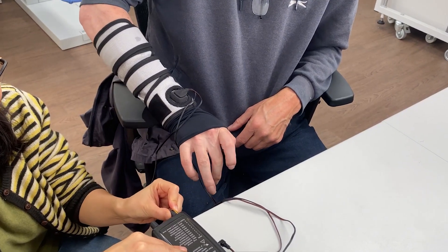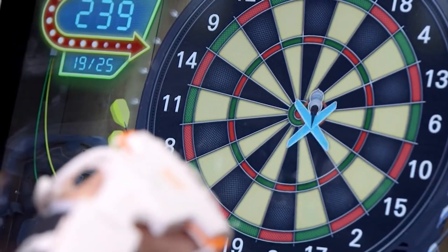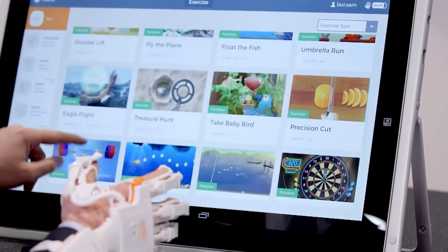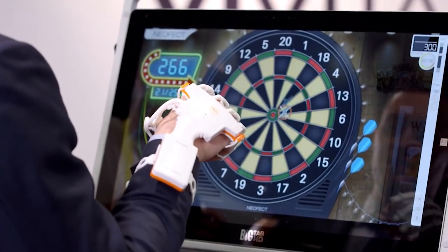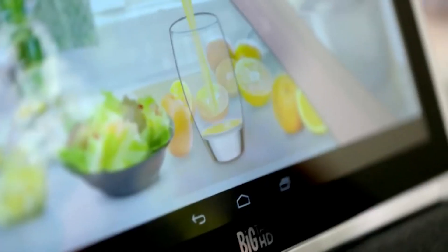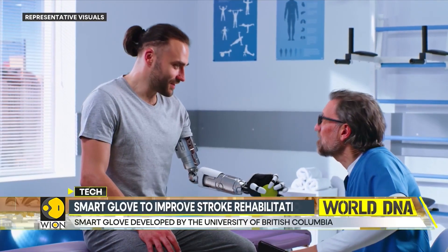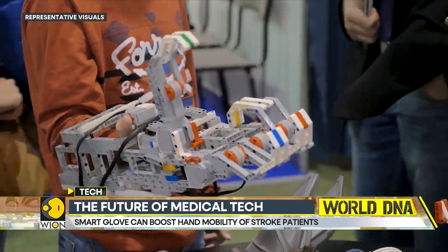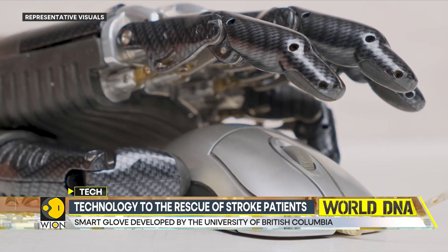The SmartGlove is not only a useful tool for stroke rehabilitation, but also a potential game-changer for other applications, such as virtual reality, augmented reality, animation, and robotics. Imagine being able to accurately capture hand movements and interactions with objects, and have them automatically display on a screen. You could type text without a physical keyboard, control a robot, or translate American Sign Language into written speech in real-time. The possibilities are endless.